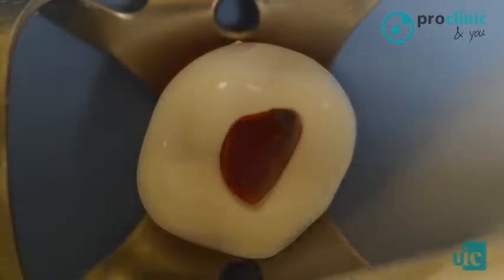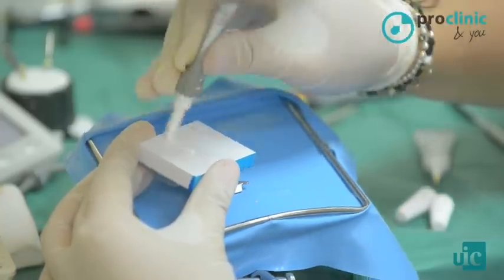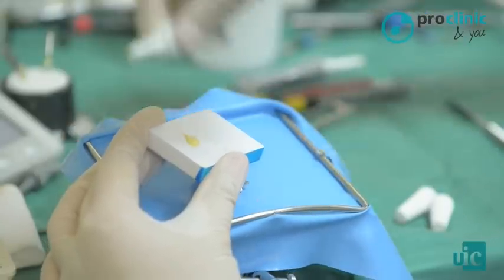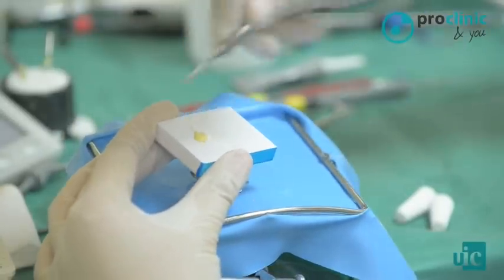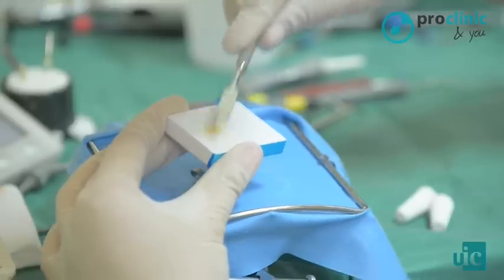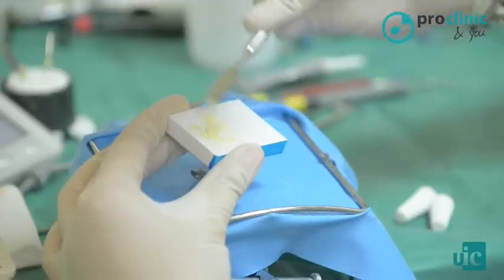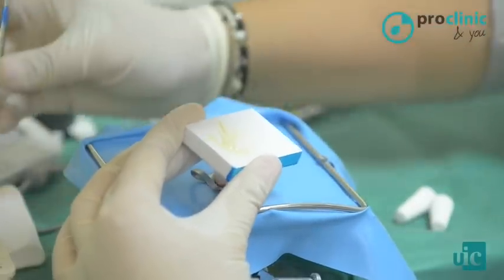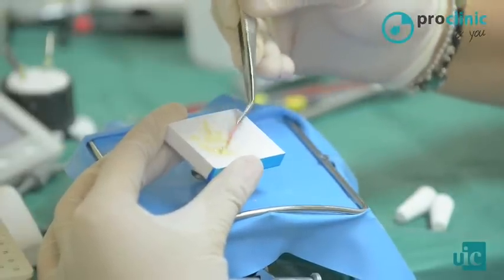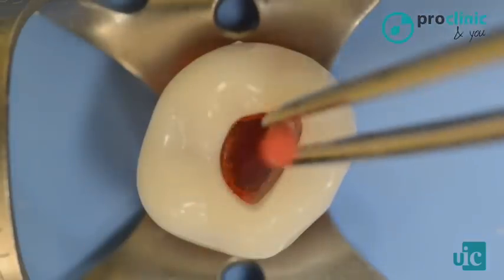We mix the sealer, cement in equal parts, and dip the gutta percha point with sealer to introduce it into the canal. We place it.